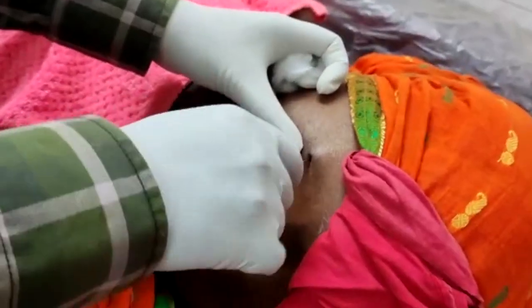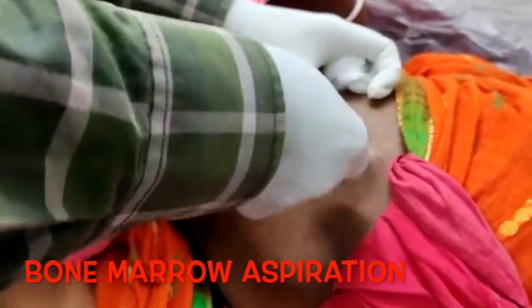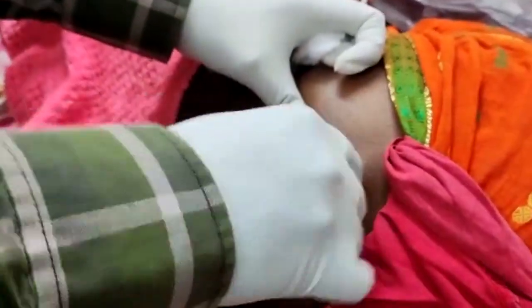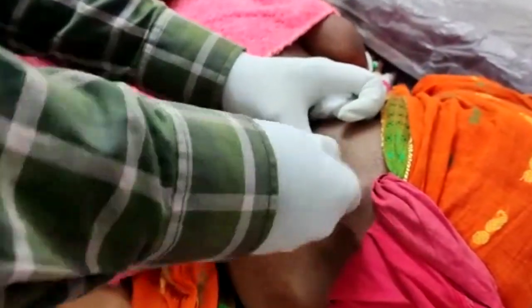After waiting two to three minutes for the anesthesia to take effect, we are going to perform the bone marrow aspiration with the bone marrow aspiration needle. The BMA needle, as you can appreciate, is inserted with a to-and-fro motion — first we pierce the periosteum and advance it until we cross the cortex of the bone. This motion has to be continued until the bone marrow aspiration needle gets fixed.